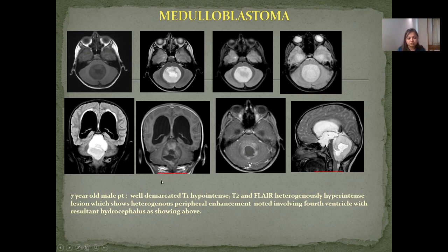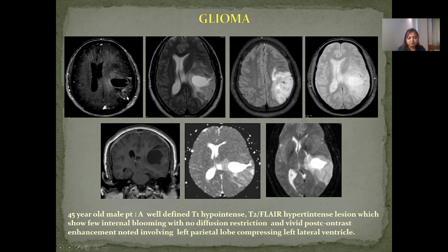Case 2 — Medulloblastoma: 7-year-old male patient with a well-demarcated T1-hypointense, T2 and FLAIR heterogeneously hyperintense lesion showing heterogeneous peripheral enhancement involving the fourth ventricle with resultant hydrocephalus. Case 3 — Glioma: 45-year-old male patient with a well-defined T1-hypointense, T2 and FLAIR hyperintense lesion with few internal blooming, no diffusion restriction, and vivid post-contrast enhancement involving the left parietal lobe compressing the left lateral ventricle.